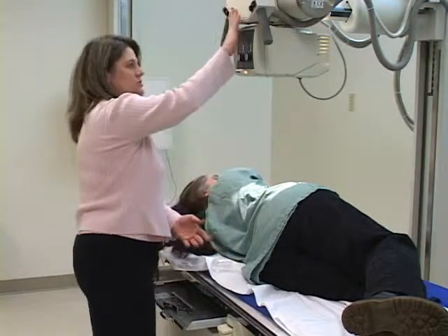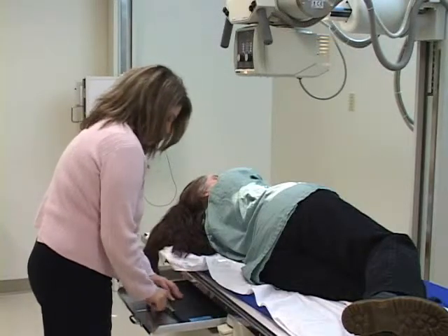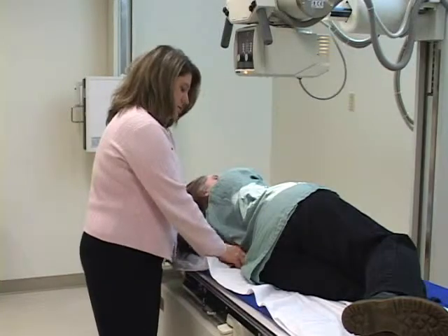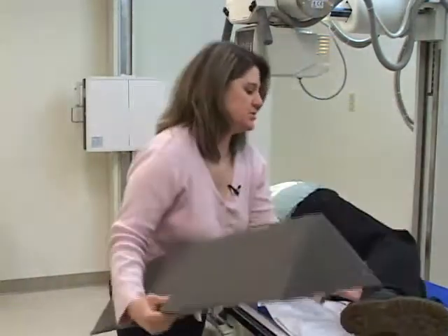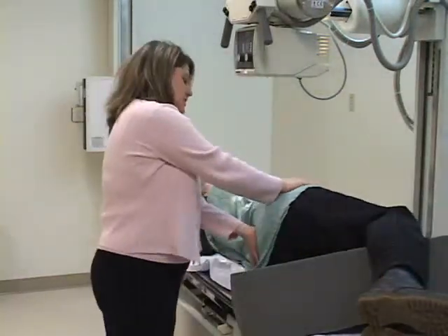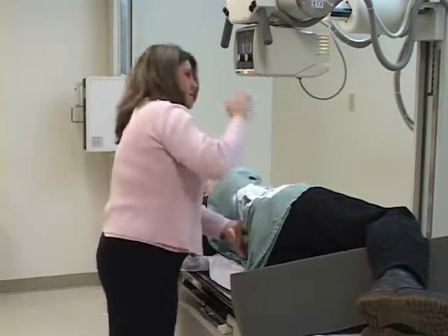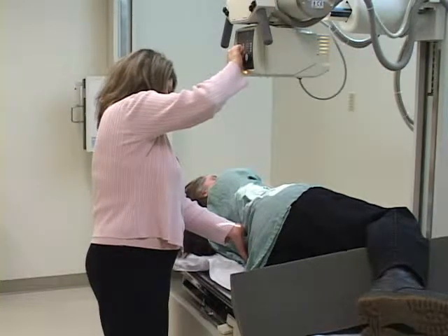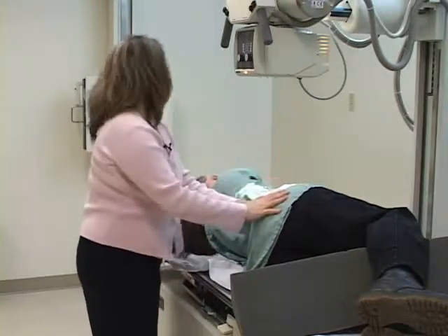Okay, make sure your tube's detented. Make sure your cassette is lined up to your tube. Okay, marker goes right behind her. Okay. One nice thing you might want to do is just put a cushion between their knees. It just makes it a little more comfortable for them and actually makes them a little more lateral. So that's just a hint. Okay, again, collimating as much as you can at a 40-inch SID. Okay, and that's how you would do a lateral abdomen.